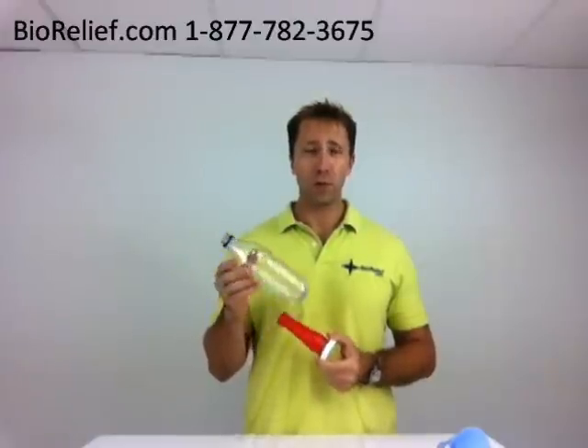Hello, my name is Jeff with Biorelief.com, and I'm going to show you the G-Funnel. The G-Funnel is a unique item that allows you to turn a standard old soda bottle — 2 liter, or this is one of the 20 ounce — into a convenient portable urinal for your car.